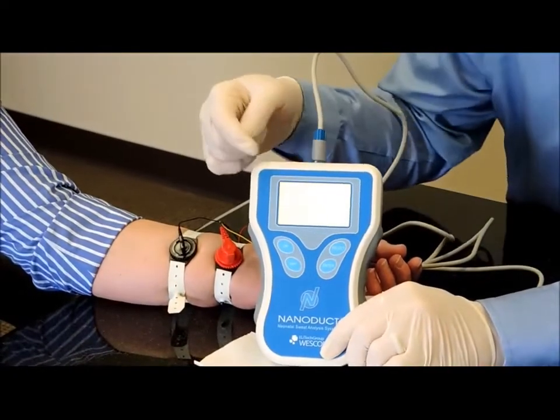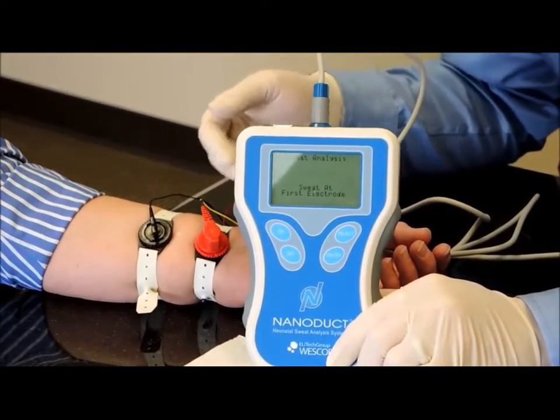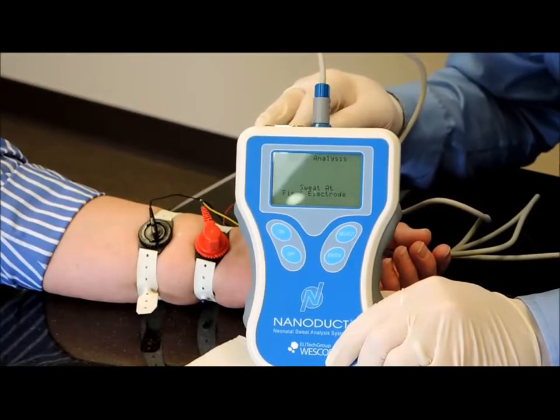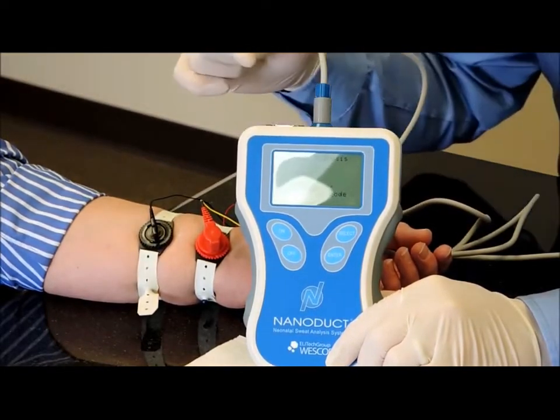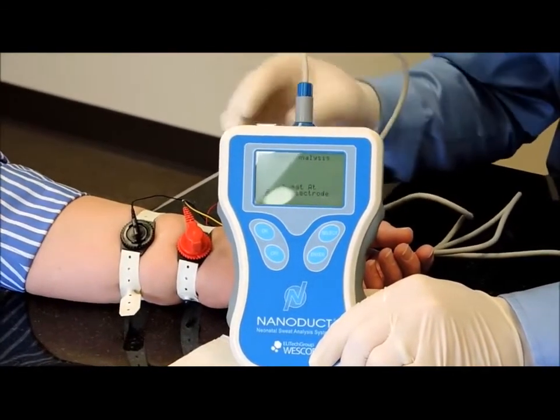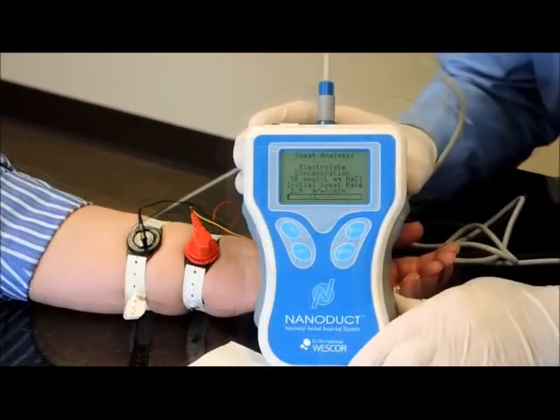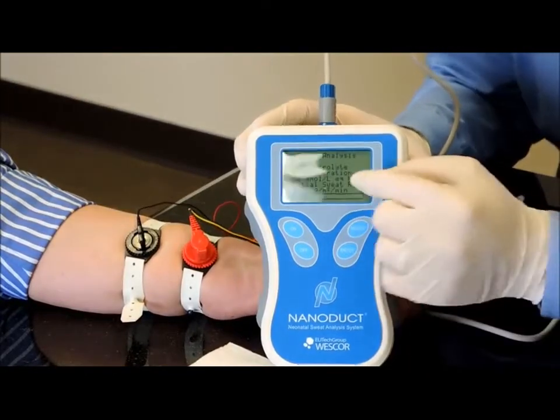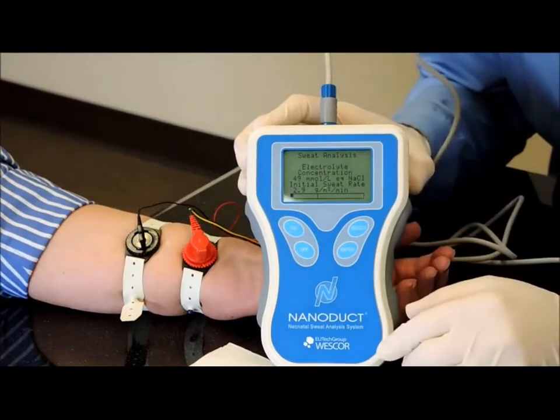So now you'll see on the screen it says sweat at first electrode. So the sweat from the patient has gotten to the first electrode in the sensor cell. So now about the same amount of time it took to get that reading, we'll see the screen change and we'll start seeing readings displayed on the screen. Now the sweat has reached the second electrode, and you'll see that the readings start appearing on the screen.